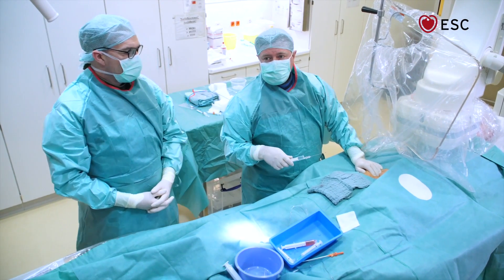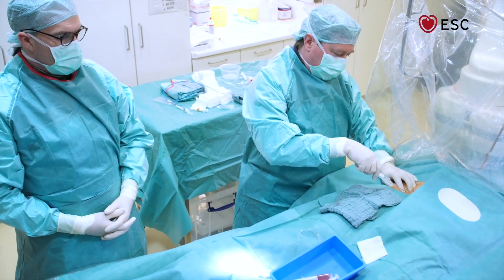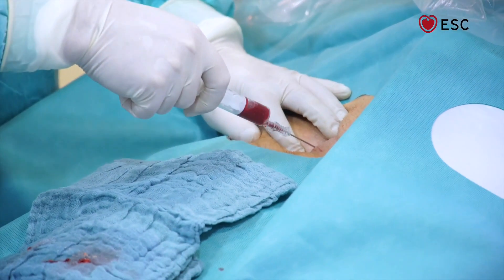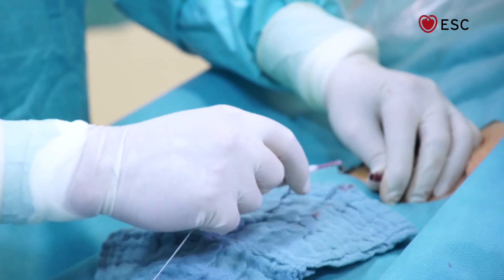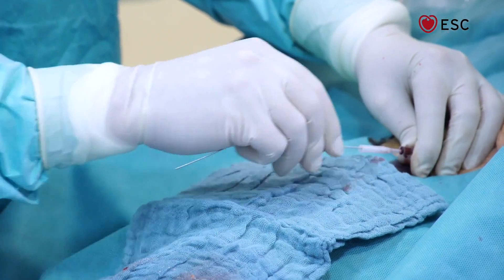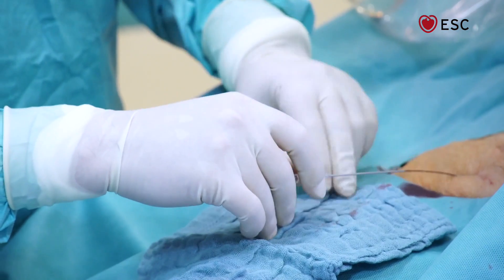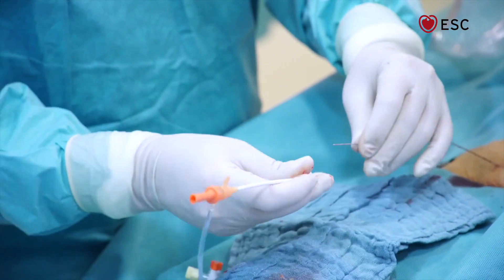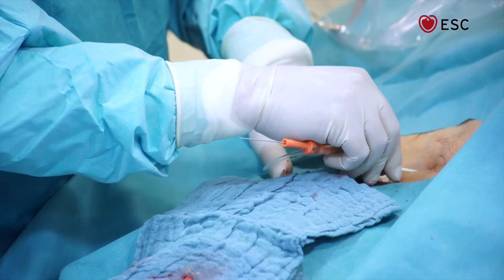There are different ways to get access to the venous system. In this case, we will puncture the femoral vein — so we put the needle in. Then through the wire, I pull the needle back, and over the guidewire I introduce a 7F sheath into the vessel.